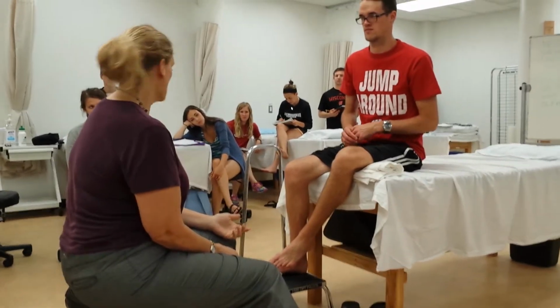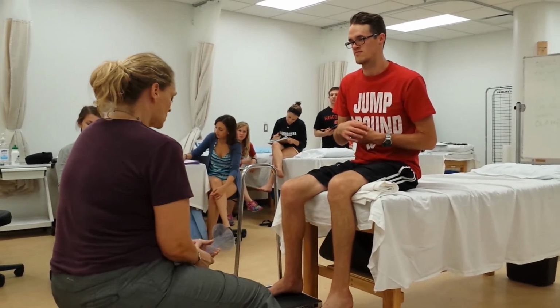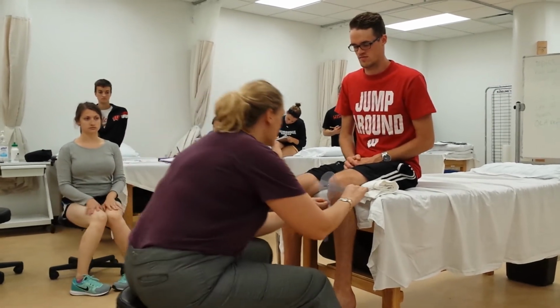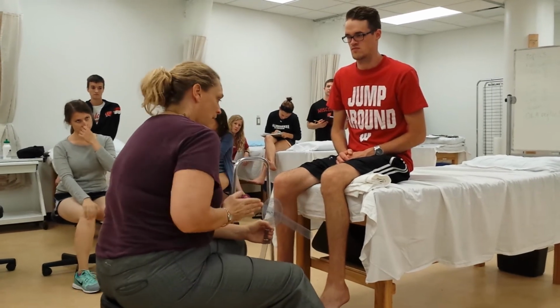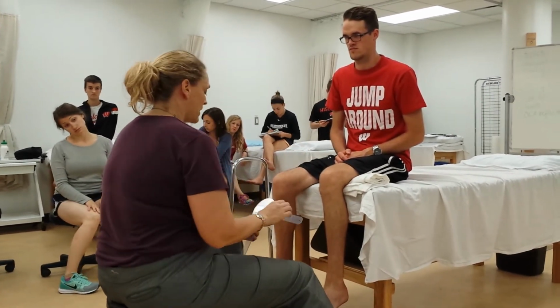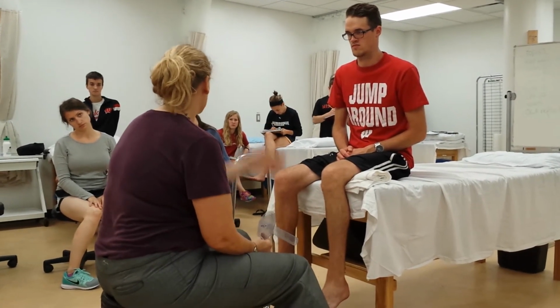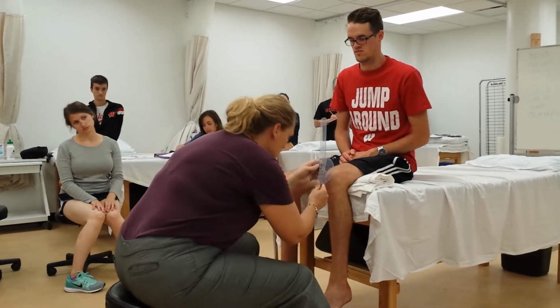Lateral. Okay? So go ahead and relax. So we can measure those from this position. We're actually going to manual muscle test them in this position as well. So the axis is going to be the inferior pole of the patella, and we're really just thinking of that axis going right along his femur. Okay? The stationary arm is going to be perpendicular to the floor, whichever direction you want. I'm tall, so I like to put it this way.